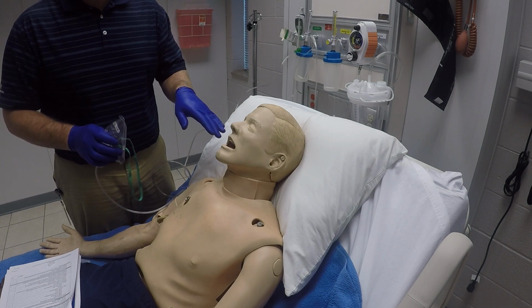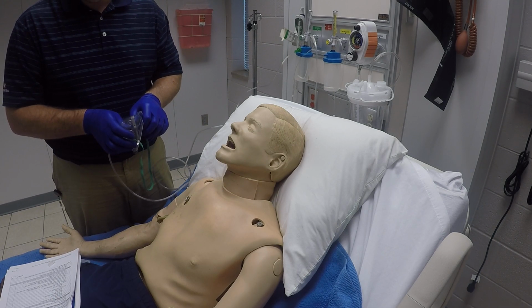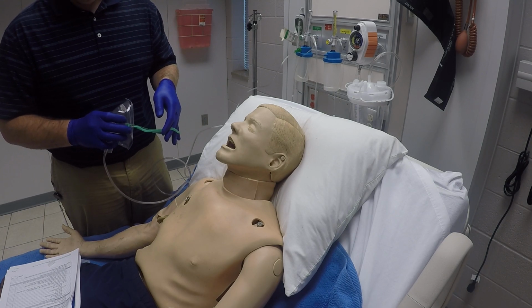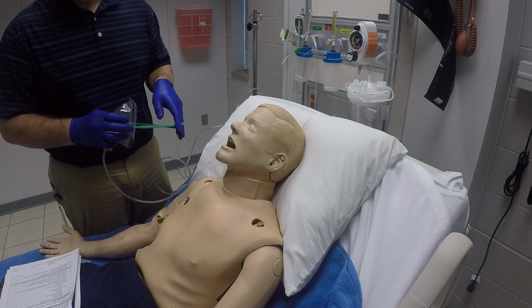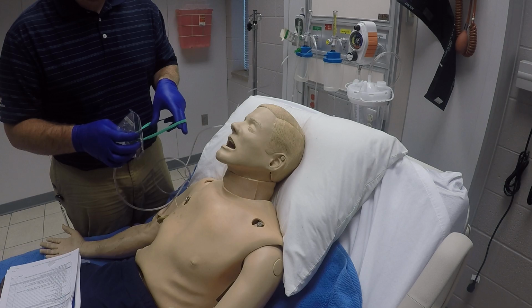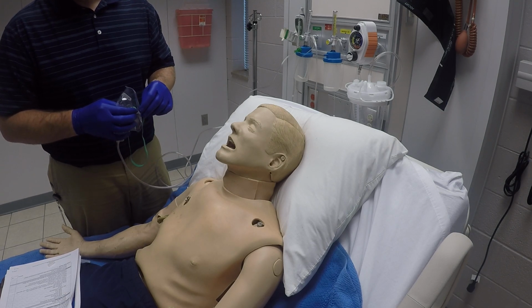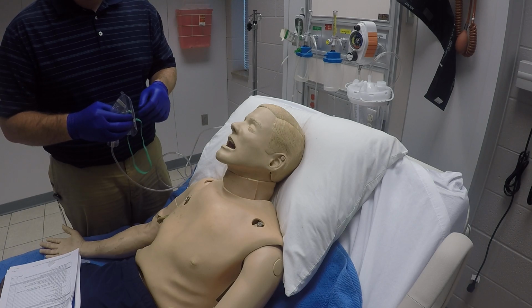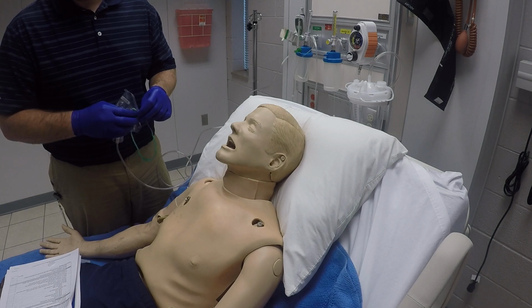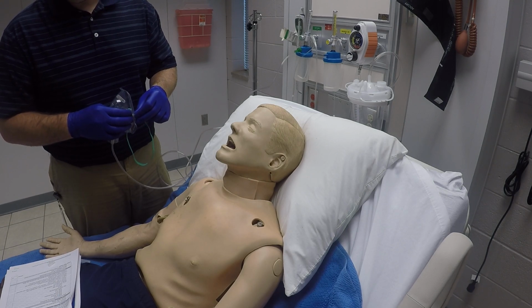If the patient has a face mask on, some sort of non-rebreather or something like that, we'll go ahead and take it off, and then we'll go ahead and put our nebulizer mask onto the patient here. And we want to be talking to the patient while we're doing all this, letting them know of what this is going to be like, make sure they don't have any allergies, explaining everything to them real well. We want to kind of do that before we give the medication to them, of course.